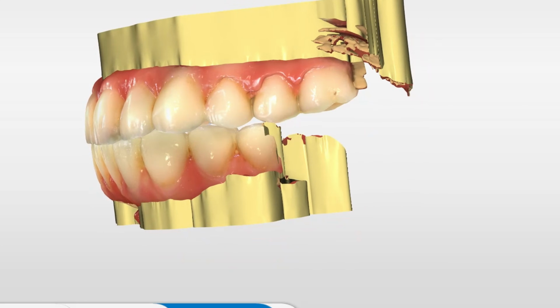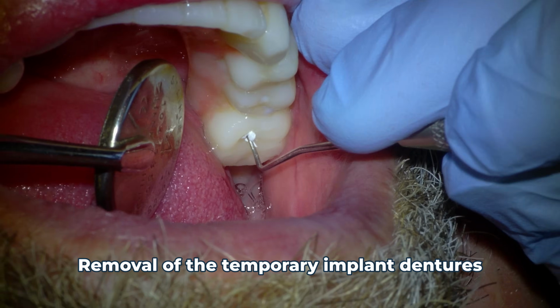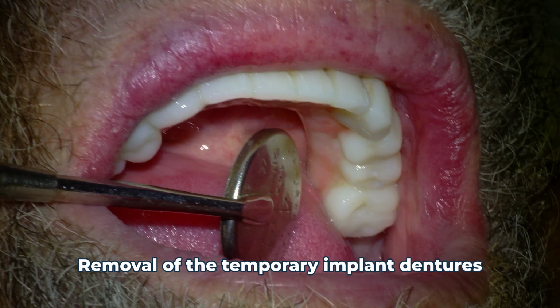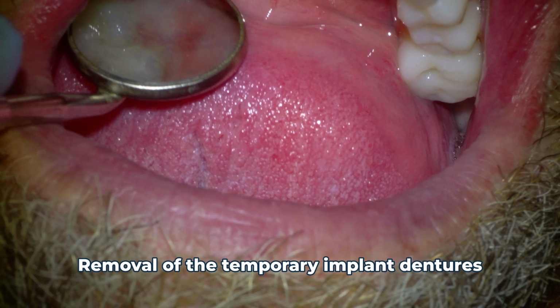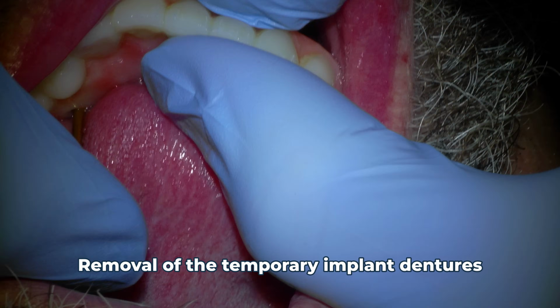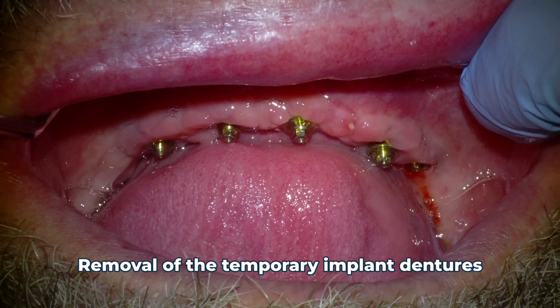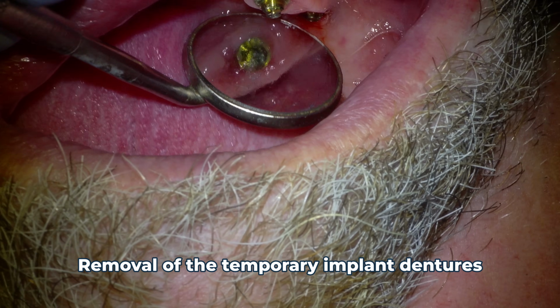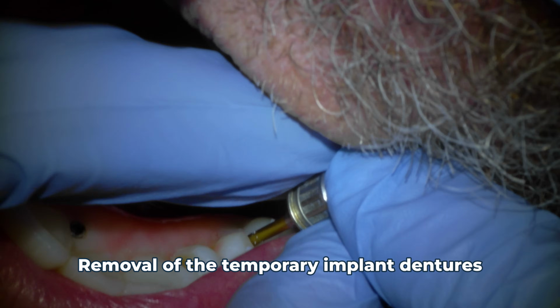After that scan, we remove and open up the fixed provisionals by drilling out the temporary fillings in the screw channels. Then we remove the little buffer material that we use to protect the screws from the drilling that we do to open these up. After that, we unscrew the prosthesis and completely remove it. And with everything out, we look at the conditions of the gums just to make sure everything's okay. And they are looking quite nice.